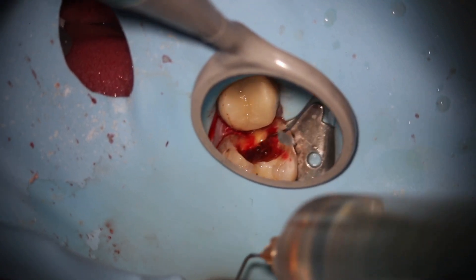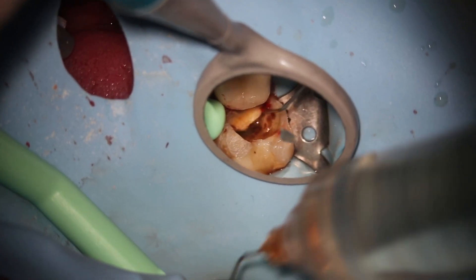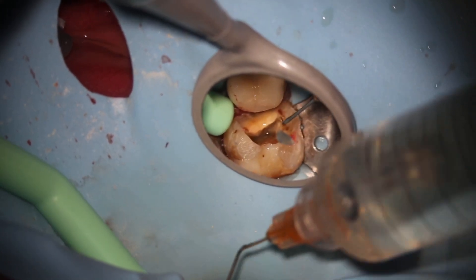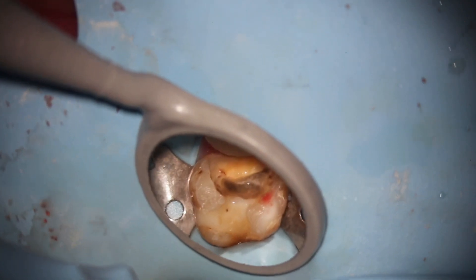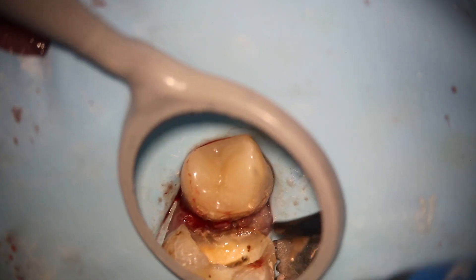Now I've got a bloody mess. I'm going to place sodium hypochlorite, but how am I going to keep it in that tooth? It's going to be hard — the mesial wall is gone and part of the buccal wall. I'm being really careful even though I have a rubber dam on. I'm using a 13a clamp, and I cut a hole on the left side, opposite the treatment side, so the patient can breathe.